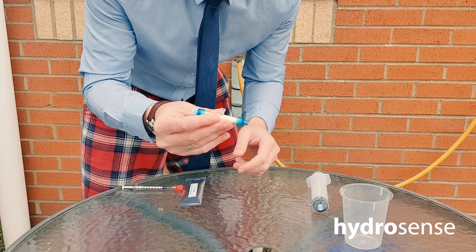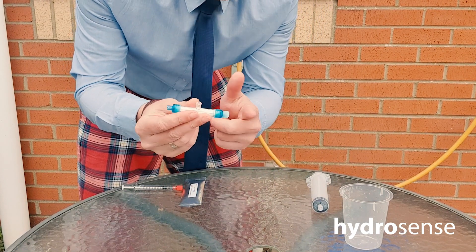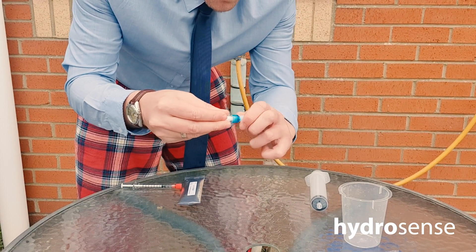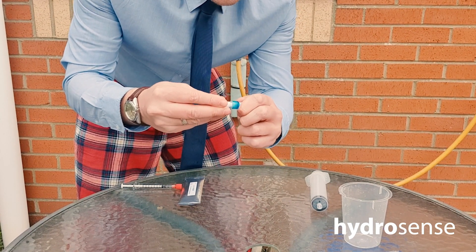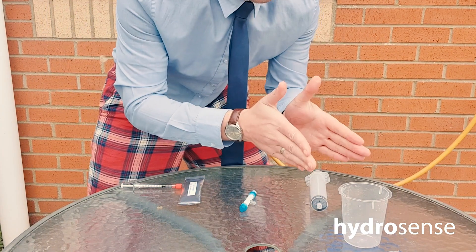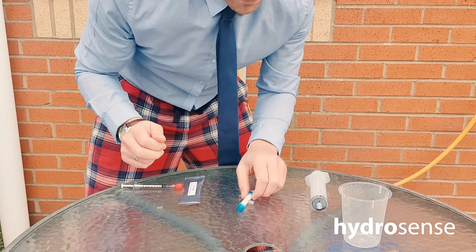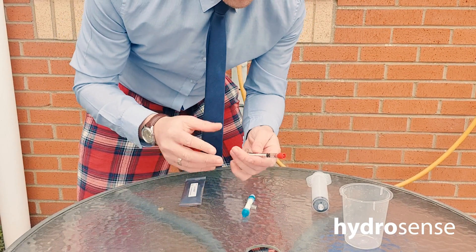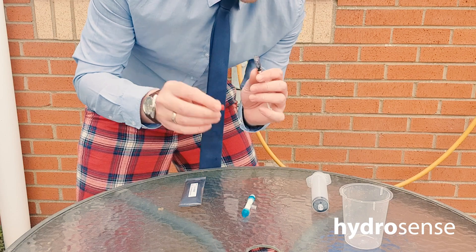Next, what we want to do is take off the white cap and switch it over to the other side, and give it a little nip there. Any Legionella that was in the water sample is now in the filter. We then take the buffer solution.